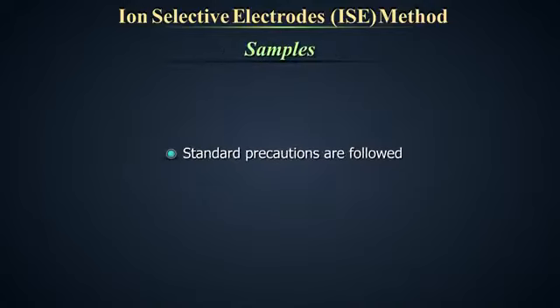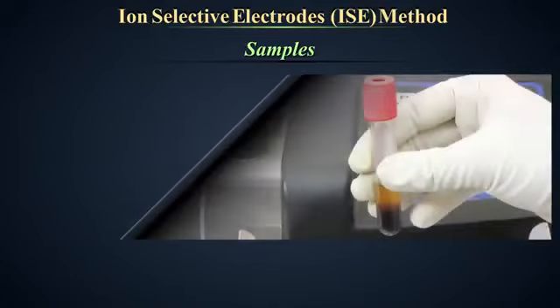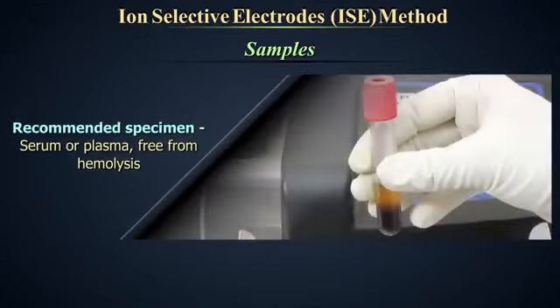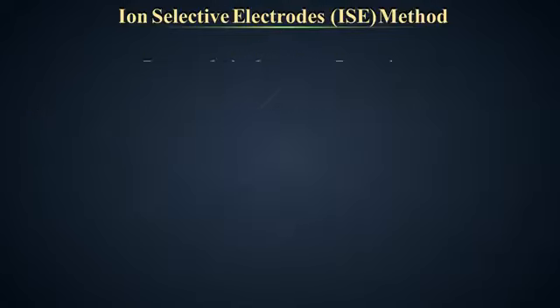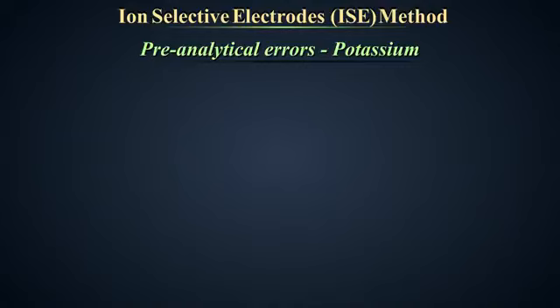Samples. All standard precautions need to be followed while handling samples. Serum or plasma free from hemolysis is a recommended specimen. Separate serum from red blood cells as soon as possible. Pre-analytical errors can occur due to the following reasons.